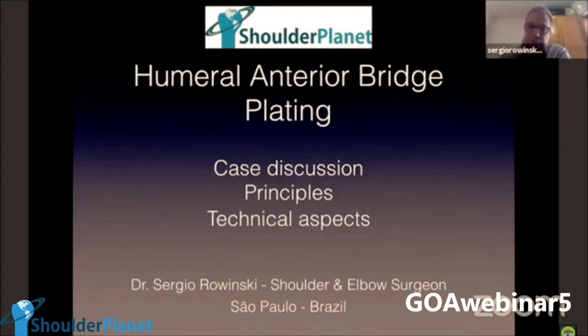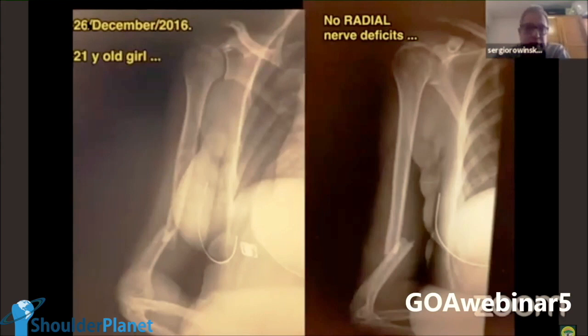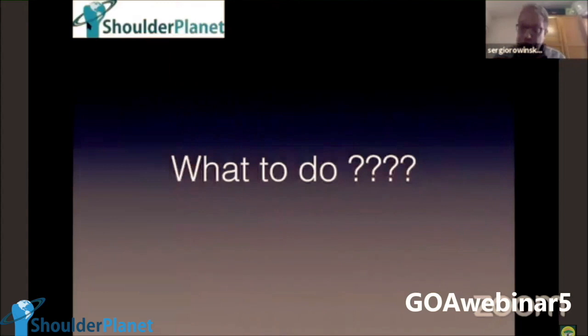So this is the first case, with no radial deficits: a 21-year-old girl with a transverse fracture in the distal shaft of the humerus. I can do all of the patterns of fractures, and this is one thing that I want to show. I love anterior bridge plating. I do this with focus, passion, but still with scientific methods, and it works tremendously in my hands. So this is the first message.